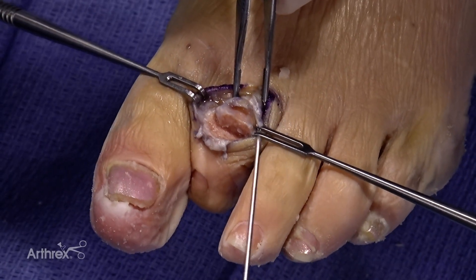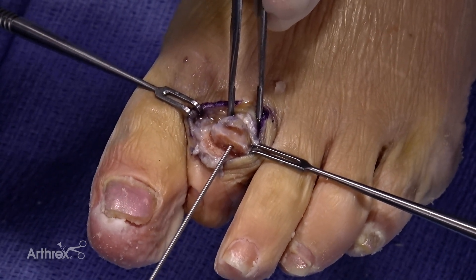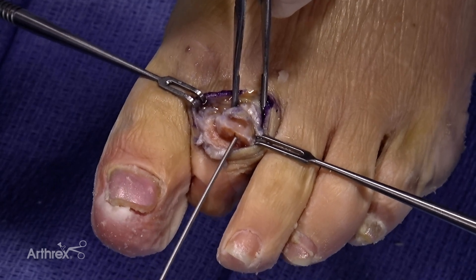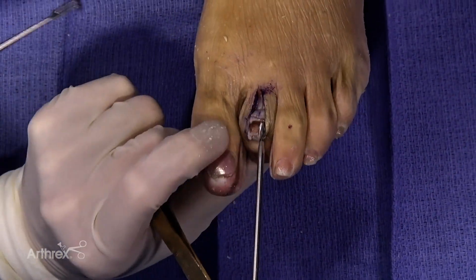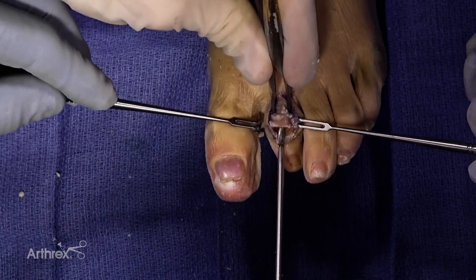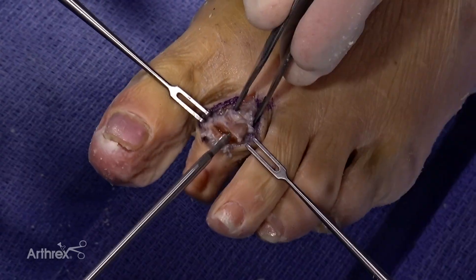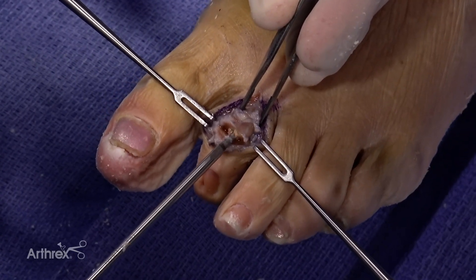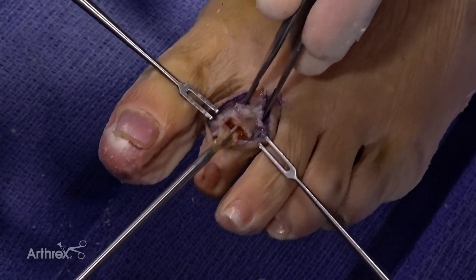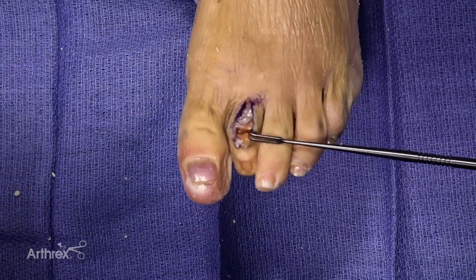Next, we use a guide wire, which is a 1.1, and we like to make sure this is going right down the proximal phalanx. It usually will find its own path. The drill is a 3.0 millimeter drill, cannulated to go over the guide wire. It does have a laser line to let you know how far you need to drill into the proximal phalanx. In soft bone, I just go nice and slow and work our way down to the laser line.